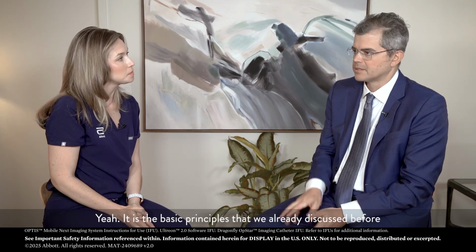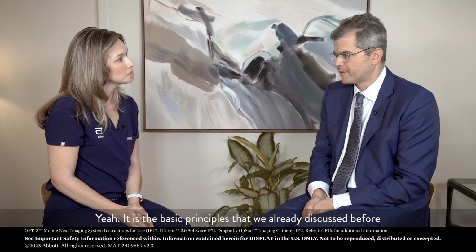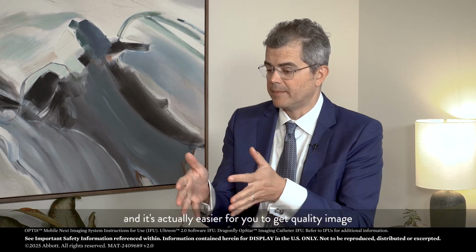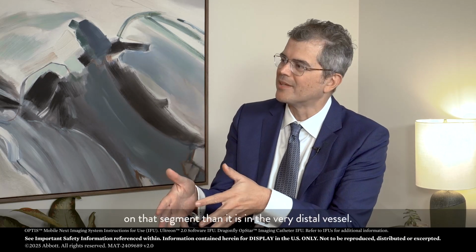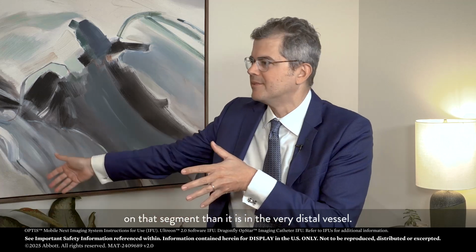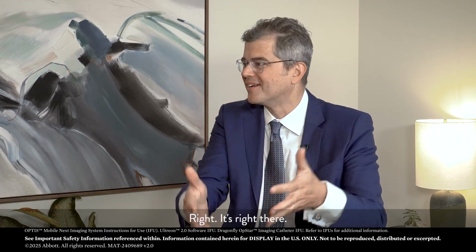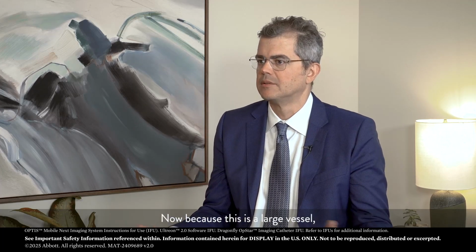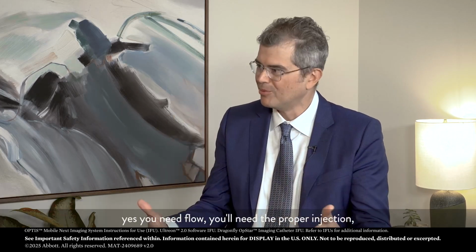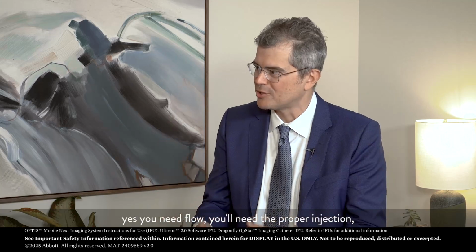Yeah, it's the basic principles that we already discussed before, and it's actually easier for you to get a quality image on that segment than it is in a very distal vessel. Now, because it's a large vessel, yes, you need flow, you need a proper injection and a good guide engagement.